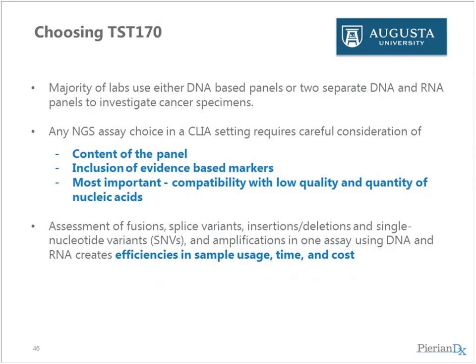So first, I would like to begin with why we ended up choosing TST-170. As with most labs, we have either a DNA-based or RNA-based panel in our lab. The DNA-based panel is mostly for the heme malignancies, and the RNA-based panel is the sarcoma fusion panel on RNA-seq.